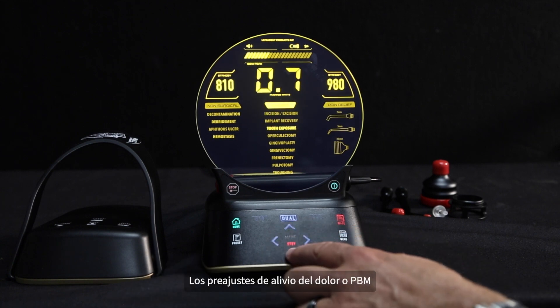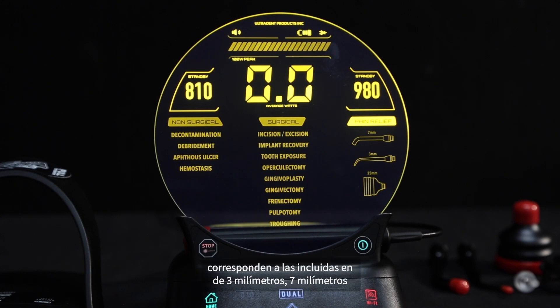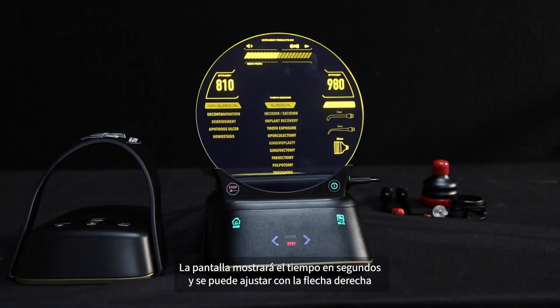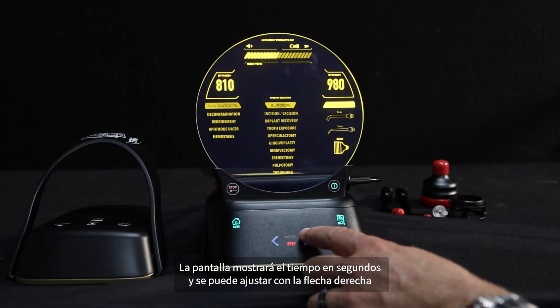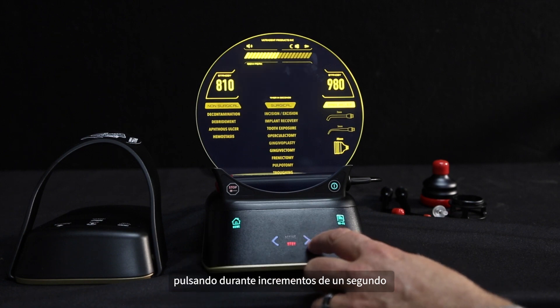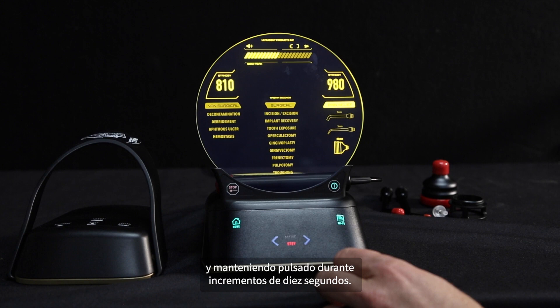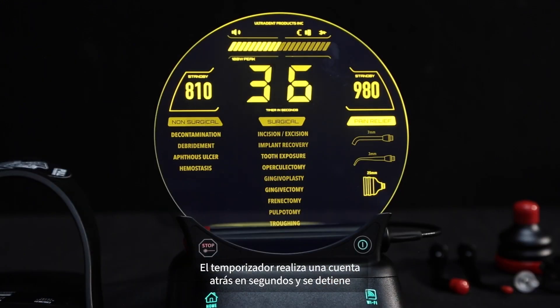The pain relief or PBM presets correspond to the included 3mm, 7mm, or 25mm adapter tip. The display will show time in seconds and can be adjusted with the right arrow by tapping for 1 second increments and holding for 10 second increments. The timer counts down in seconds and stops automatically after treatment time is completed.